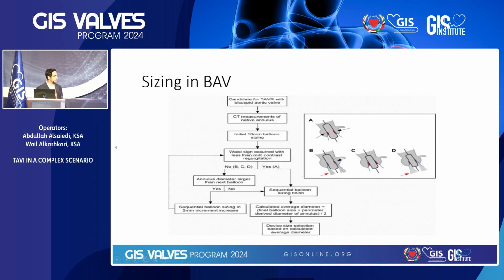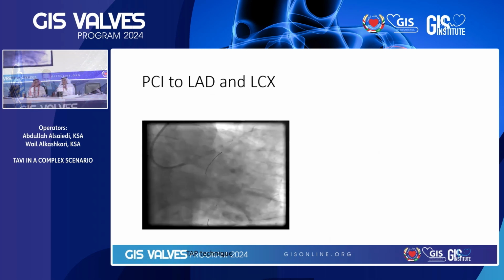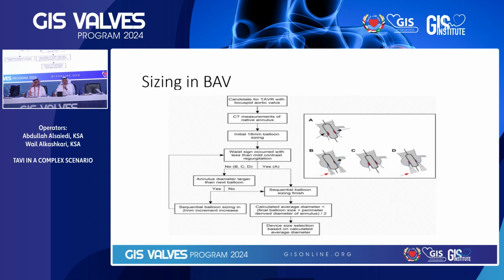Abdullah, just 1 second. So the sizing depends on the platform you want to use.